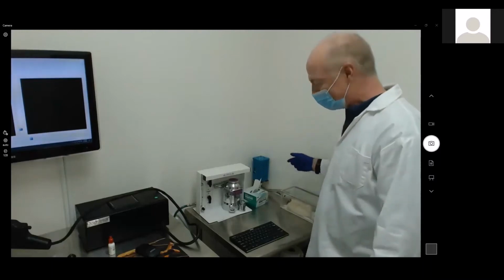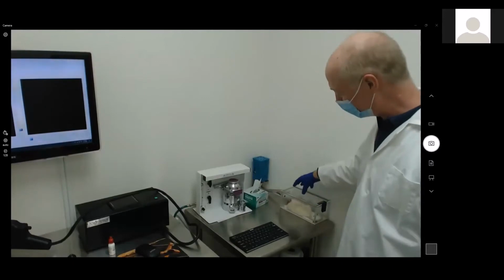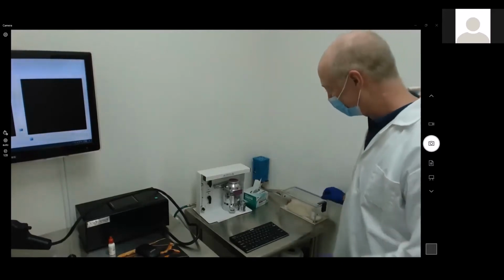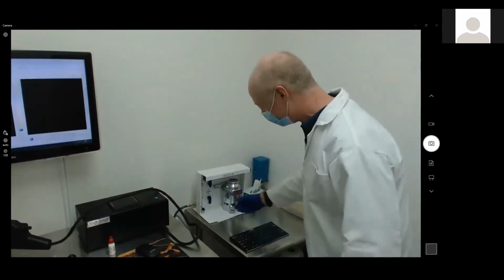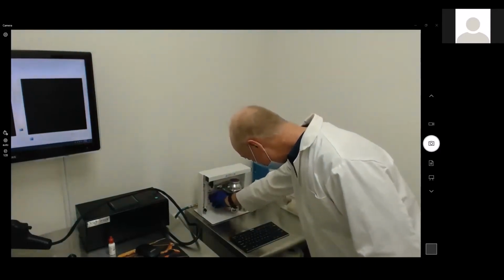So I'm going to move Fat Rat out of the induction chamber, which, as I showed with the mouse, is also of a size to do a rat. And then I'll make the switch over to her face mask.